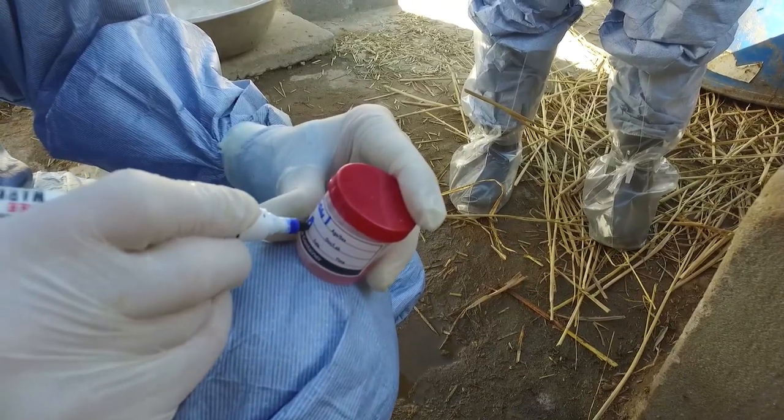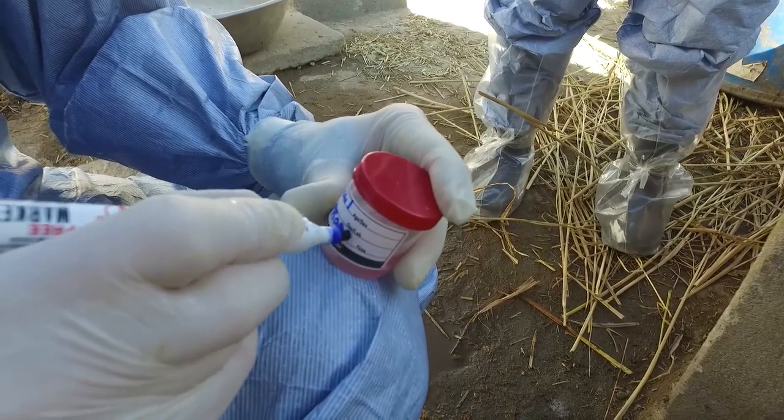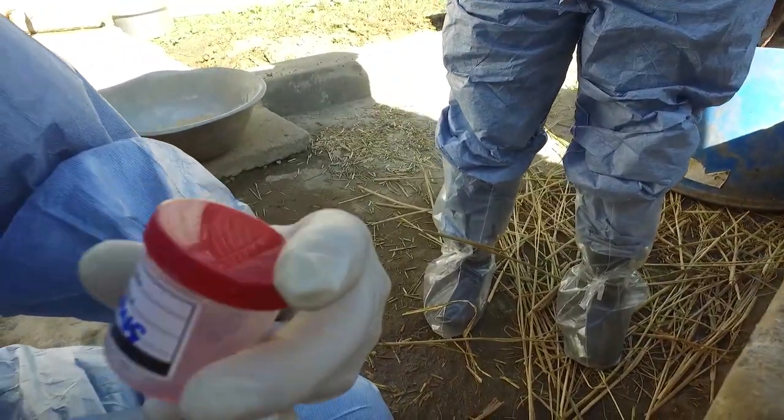Remember to label the sample correctly. The sample needs to be kept cool and transported to the laboratory as quickly as possible after packaging in a biosecure manner.